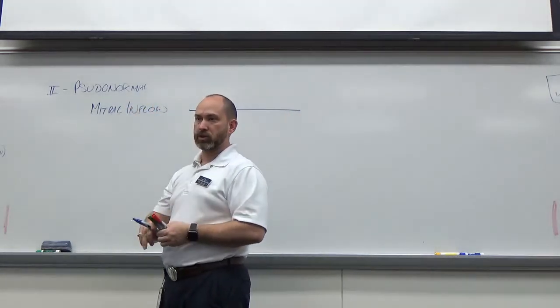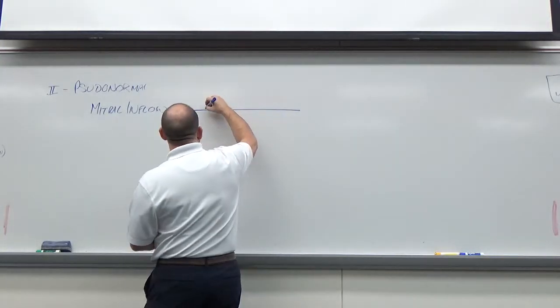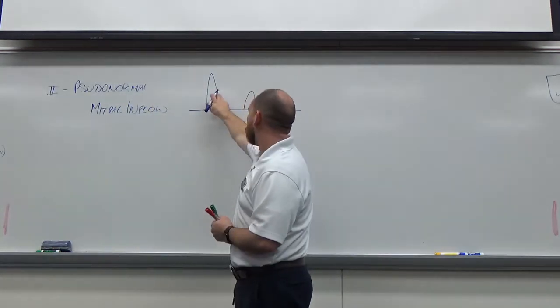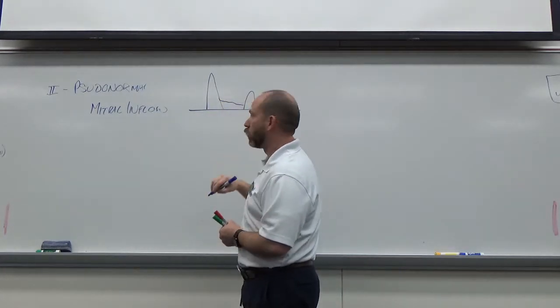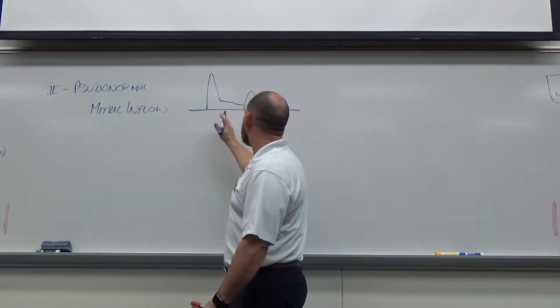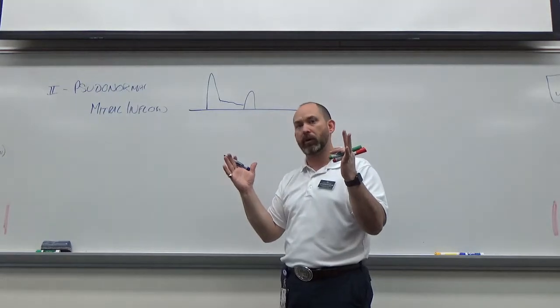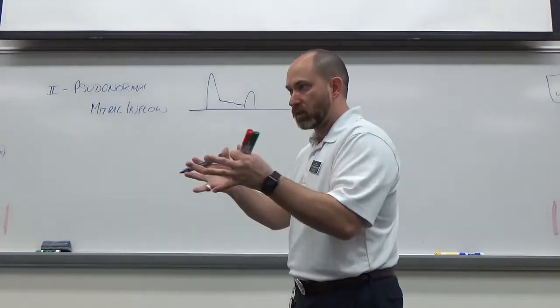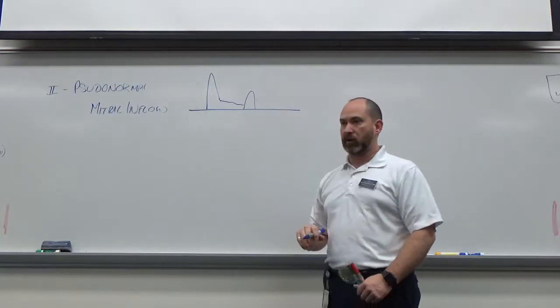This is why it's called pseudo-normal, because it looks like the normal did. My E wave is higher than my A wave. I draw it like this, but don't be thrown if I do a full diastasis type of flow in there. That's okay. There could be greater difference on timing of these events too, depending on my EKG and how fast the heart rate is. The faster it goes, the more it's going to smush together. So don't be thrown by the distance between that either. So that's our first clue that things are looking good.